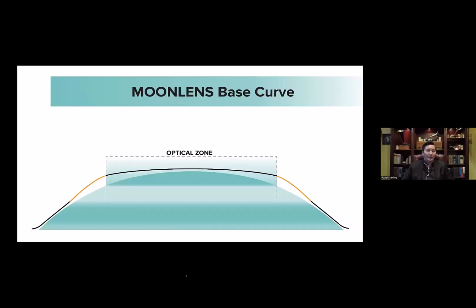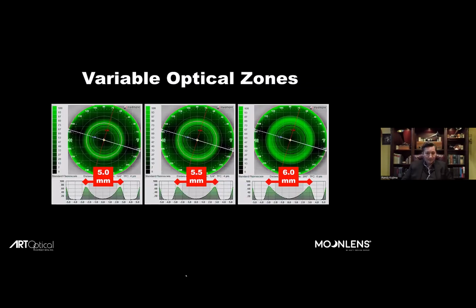The second is optic zone and base curve selection. And this, of course, will be based on the Jessen factor. So if we want 3 diopters flattening, we're going to use a base curve 3.5 diopters flatter. We're going to add in that fudge factor of a half diopter to try to take that patient to a flattening that gives them plus 0.50 AM vision after removal.